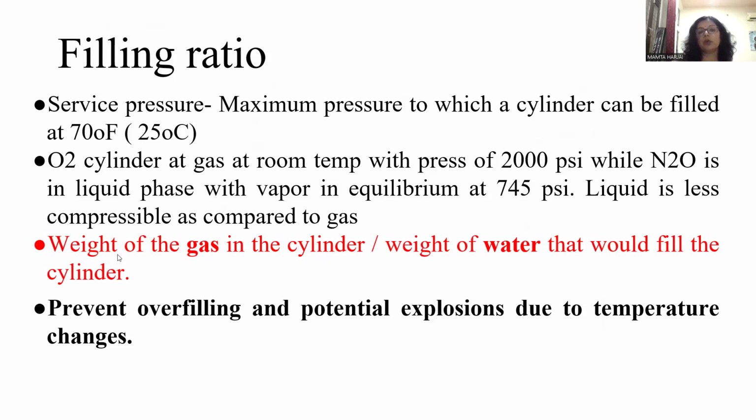Now, you should know that liquid is less compressible as compared to gas. So we cannot completely fill the cylinder; we have to partially fill it, because there's always a risk of overfilling and potential explosion due to temperature changes. As temperature rises, the liquid expands. So what is filling ratio?